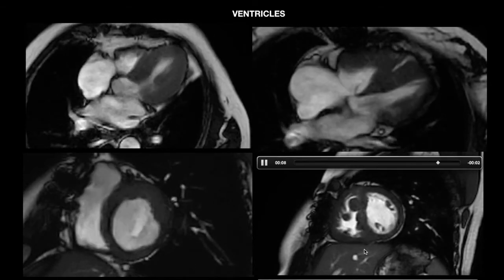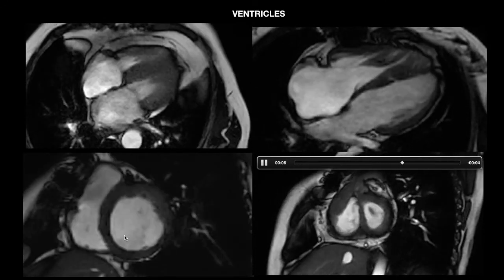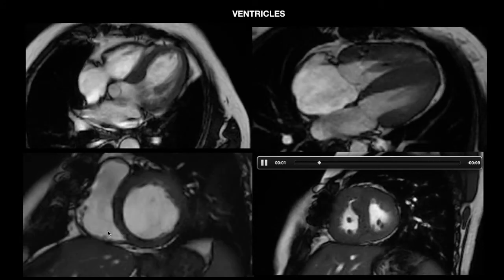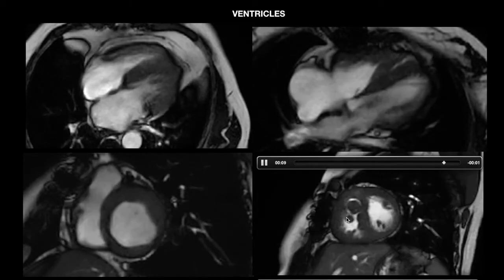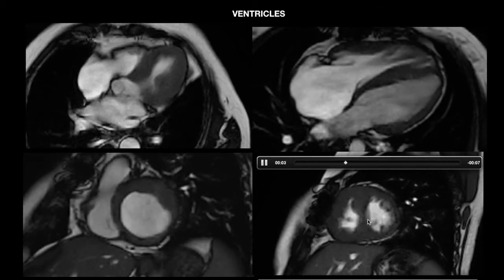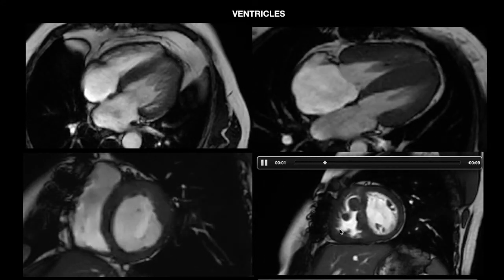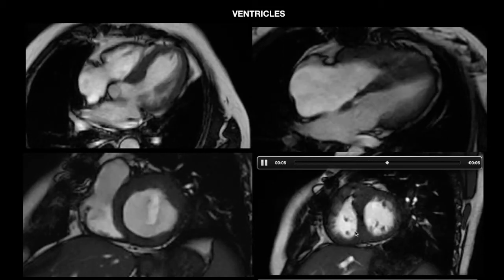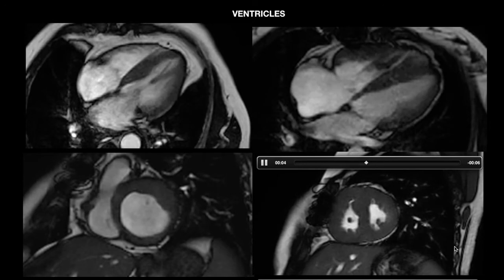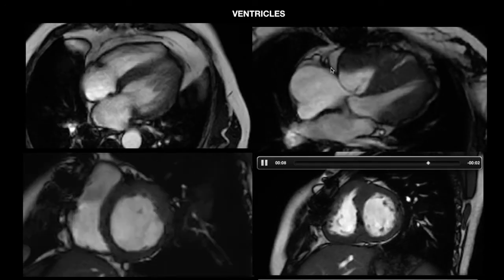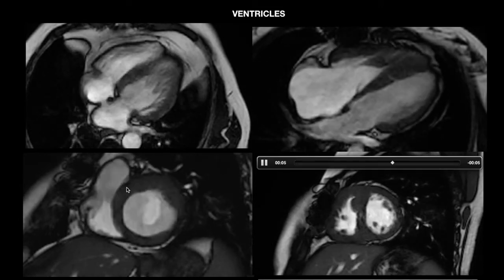During ventricular contraction, look at the interventricular septum. In a normal physiological state, the interventricular septum should always be convex toward the right ventricle, giving a circular shape to the left ventricular cavity. If there is increased pressure on the right ventricular side, the interventricular septum can become a straight line or move towards the left ventricle during systole as well as diastole, as seen in this example. The increased pressure gradient on the right side causes increased thickness of the right ventricular chamber as well as leftward septal movement. We should also look at the right coronary artery in the right atrioventricular groove, the LCX in the left atrioventricular groove, and the LAD in the anterior interventricular groove.